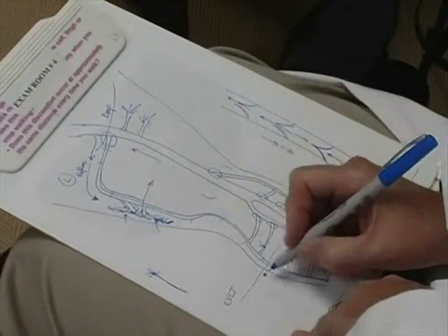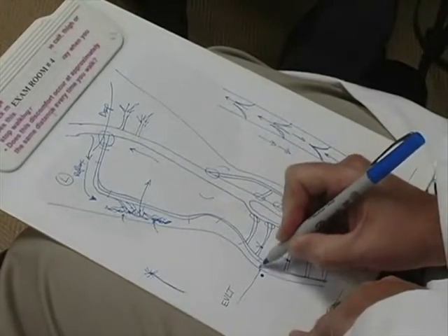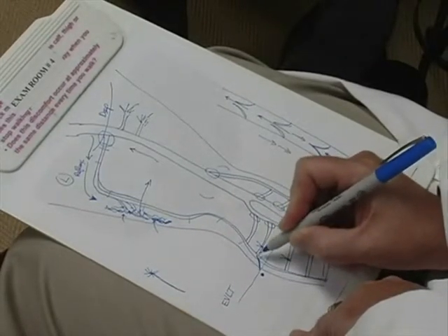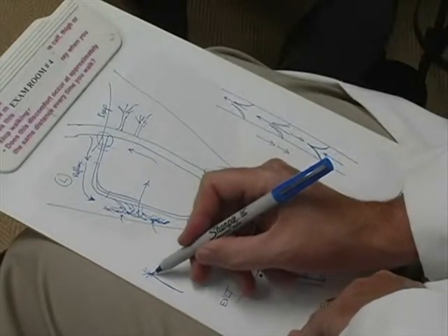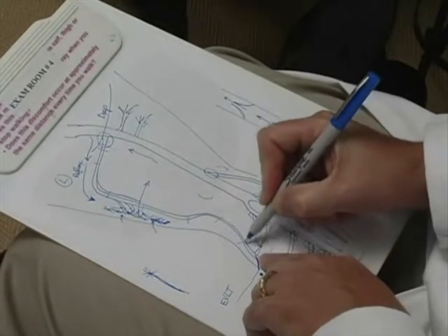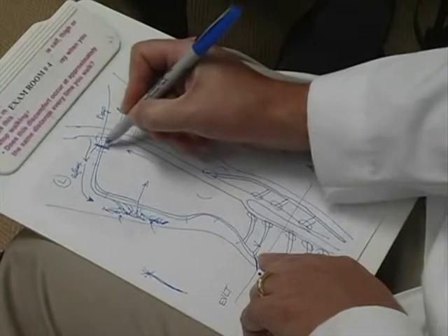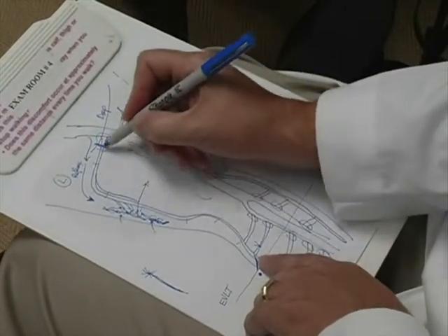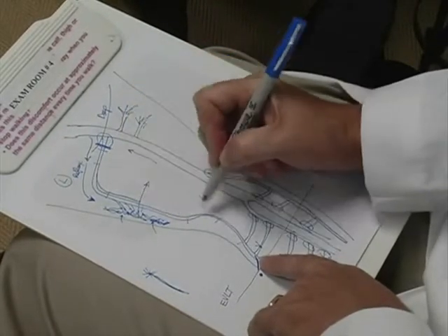The EVLT, we numb a place at the skin surface and we start a small IV directly into the vein using ultrasound guidance. With a laser fiber, that same fiber optics, we run a laser fiber, float it up to this point right here. Most people say that it feels like a crawling sensation. It doesn't cause pain, but just an odd sensation.